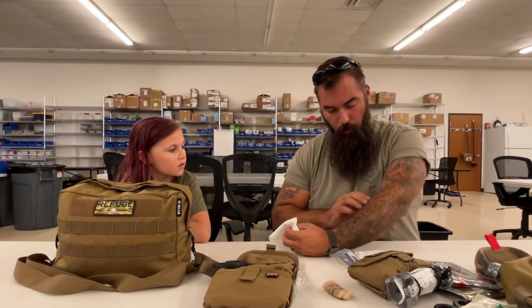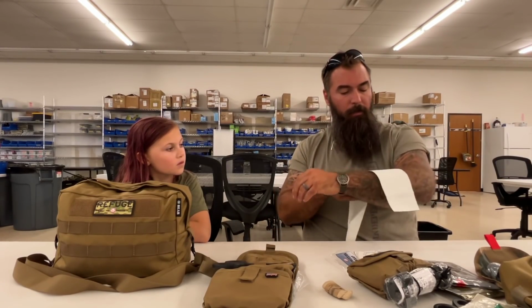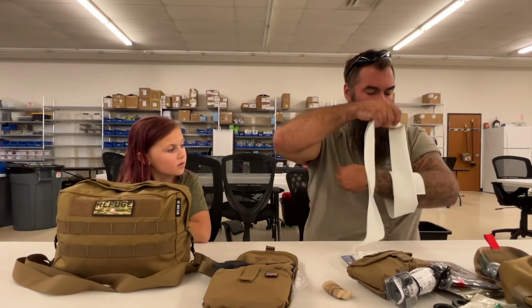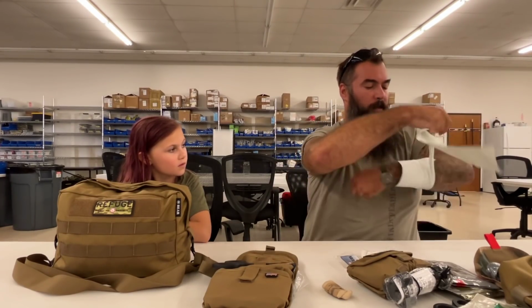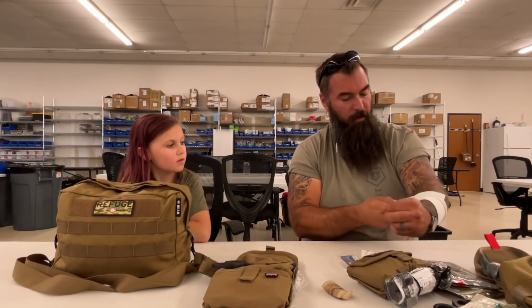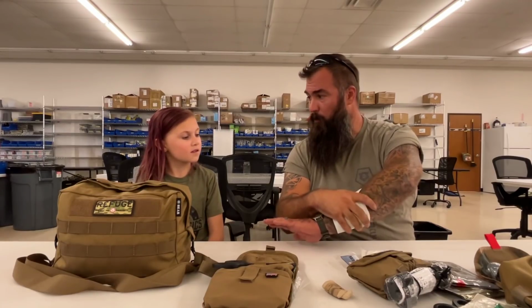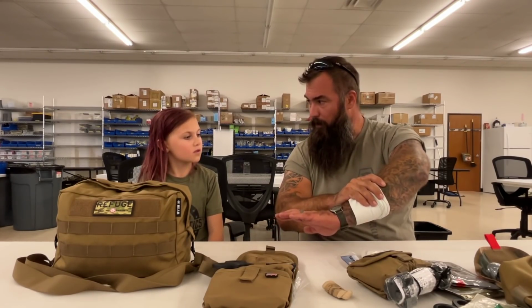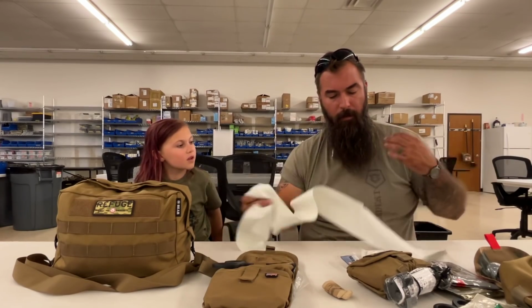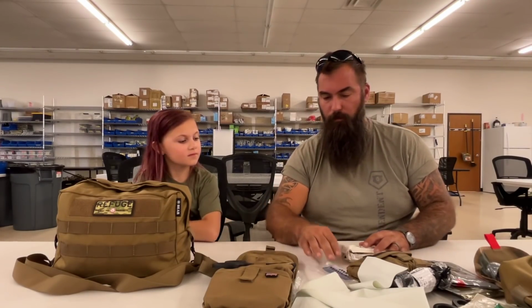And so if we had a wound on our arm or something where we had to stick some gauze in there and then we needed to hold it in place, you would wrap that around. Get it started, pull tight like so, and then you just tuck the end underneath like so. And now I've got compression on that wound to hold everything together. So it's a cool little piece of kit, right? So that's compression, which we use for dressing wounds.